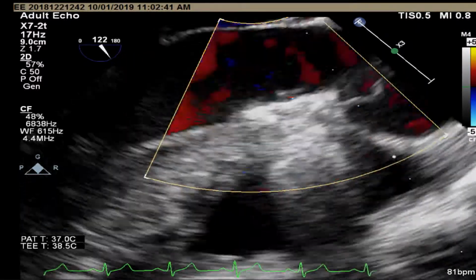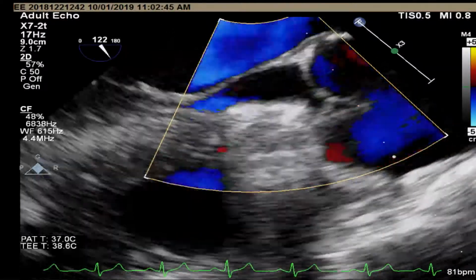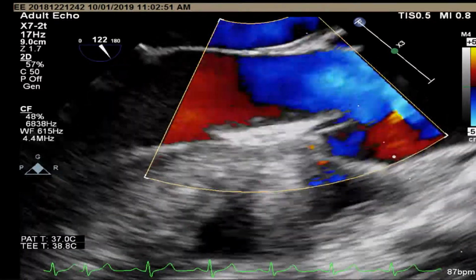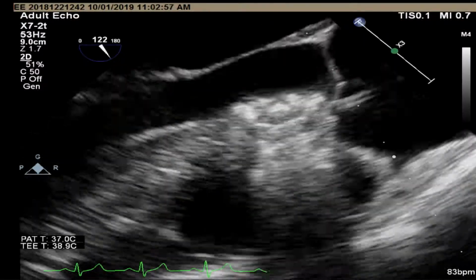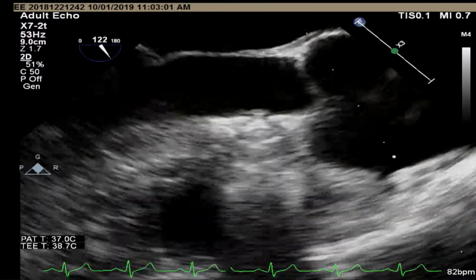Yeah, I can. No, I'm not keen on an aortogram. Maybe I can do an LV angiogram. There is no AR at all, so an aortogram is not going to be of great use. Okay, I'll do that now. Two angiograms, one for the aortogram and then one for the LV angiogram.